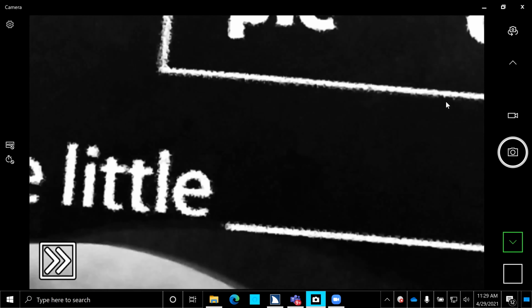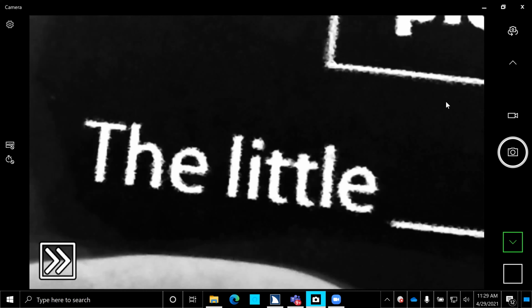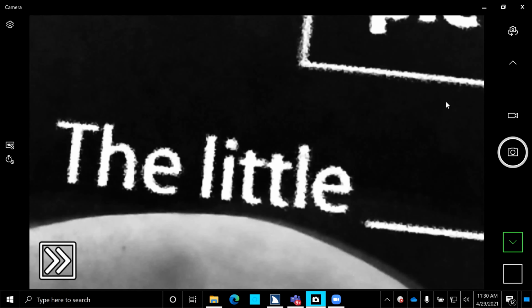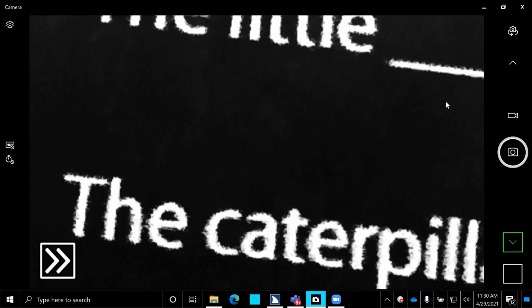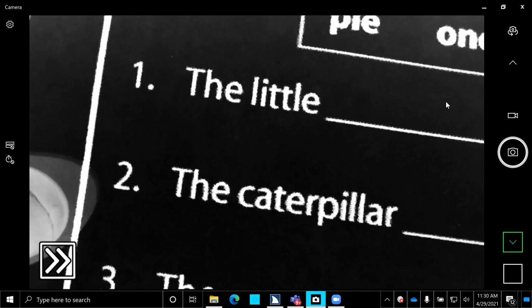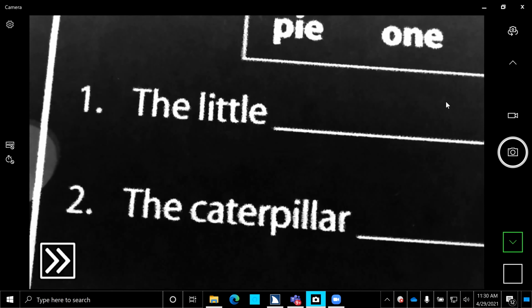So I'll just demonstrate a few things here. I have so little vision that I always tell people I have enough vision to get myself in trouble, really is what I have. But when you look at how this is, I'll zoom it out. And all I'm doing is using the touch screen, just doing the pinch to zoom. But I can also use any of the side buttons.